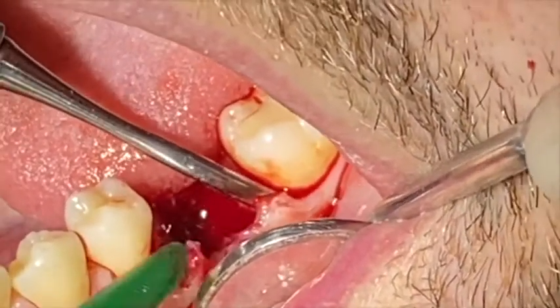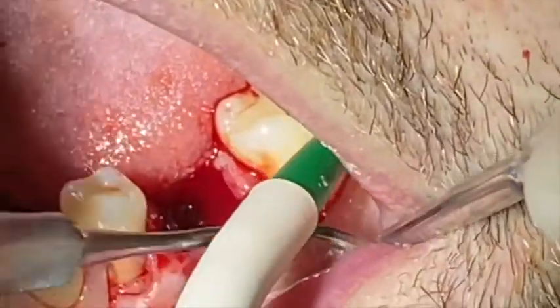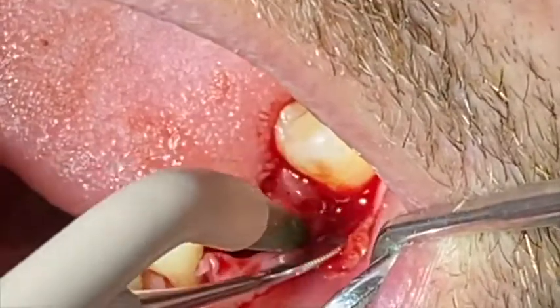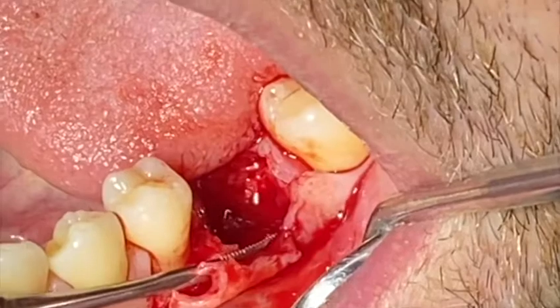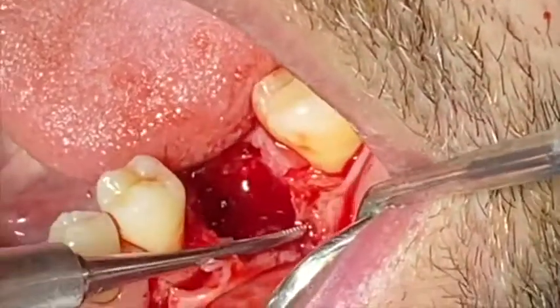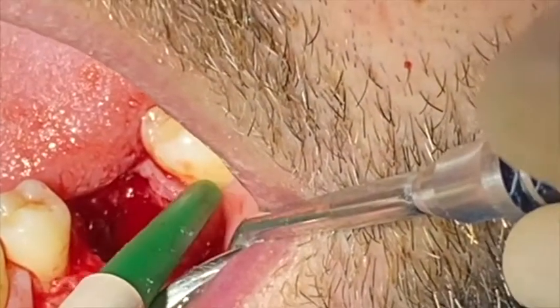I need to lean on the bone, but then I'm going to make a lever movement, trying to displace the flap by these lever movements. So the tip of my instrument is not touching the flap. I'm leaning on the bone, which is the part of the area that is protected and more stable.